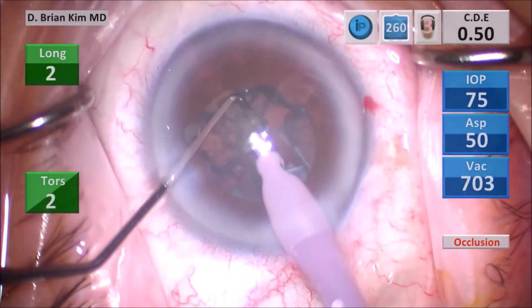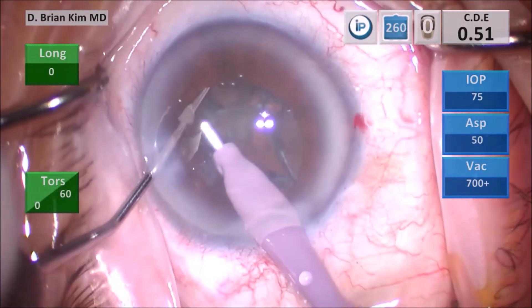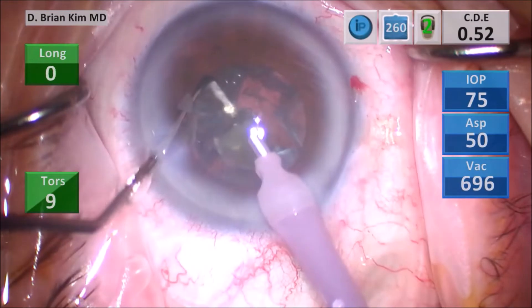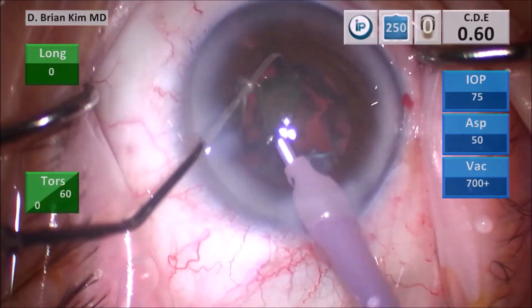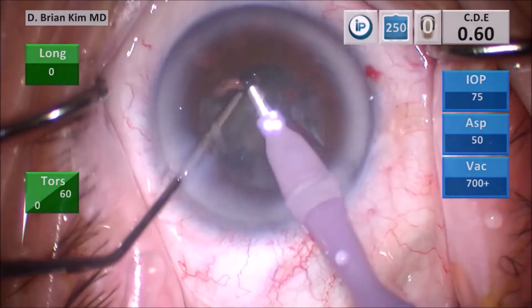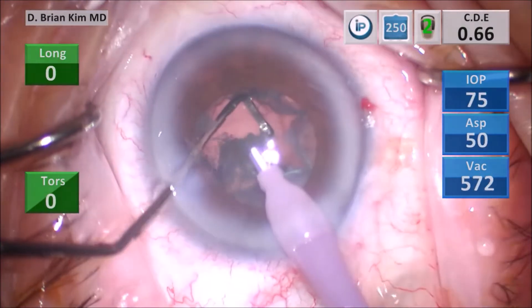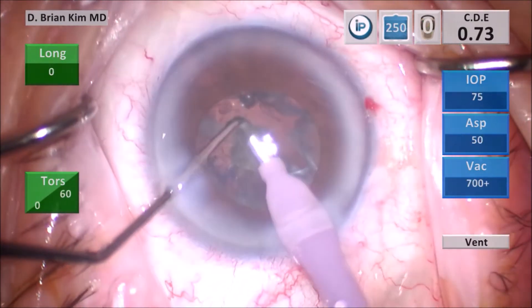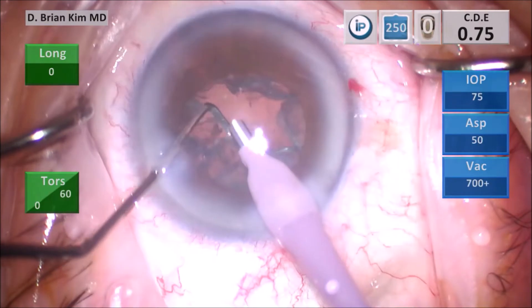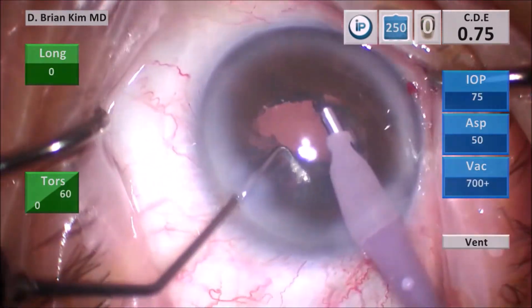I repeat the same maneuver — placing the chopper out to the equator, crushing the lens piece between the chopper and the phaco tip into smaller bite-sized pieces, then using intermittent bursts of ultrasonic energy and vacuum. Once all the endonucleus is removed, I remove the epinuclear material. I don't use a separate setting for this because I feel comfortable with foot pedal modulation to control the amount of vacuum.